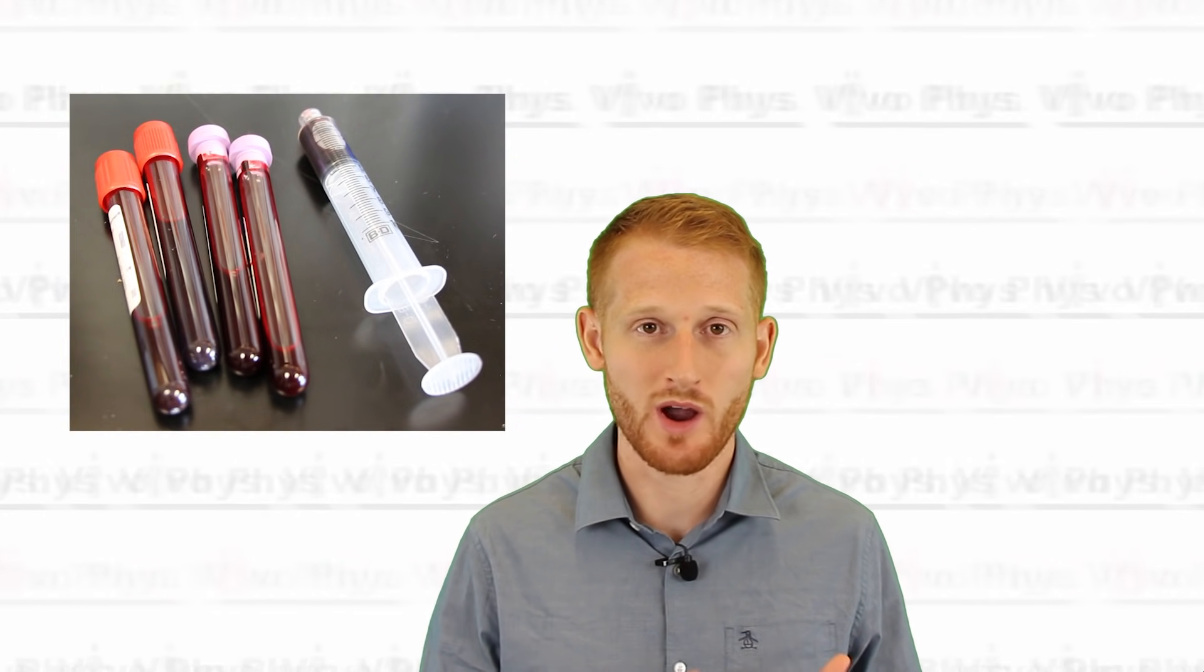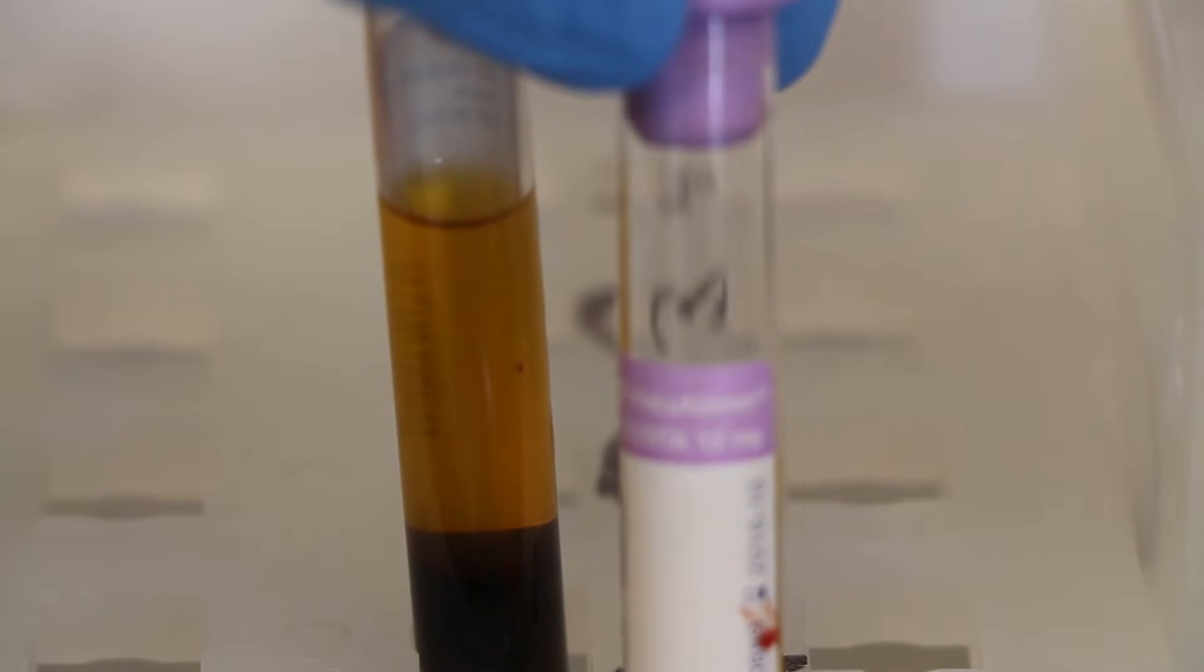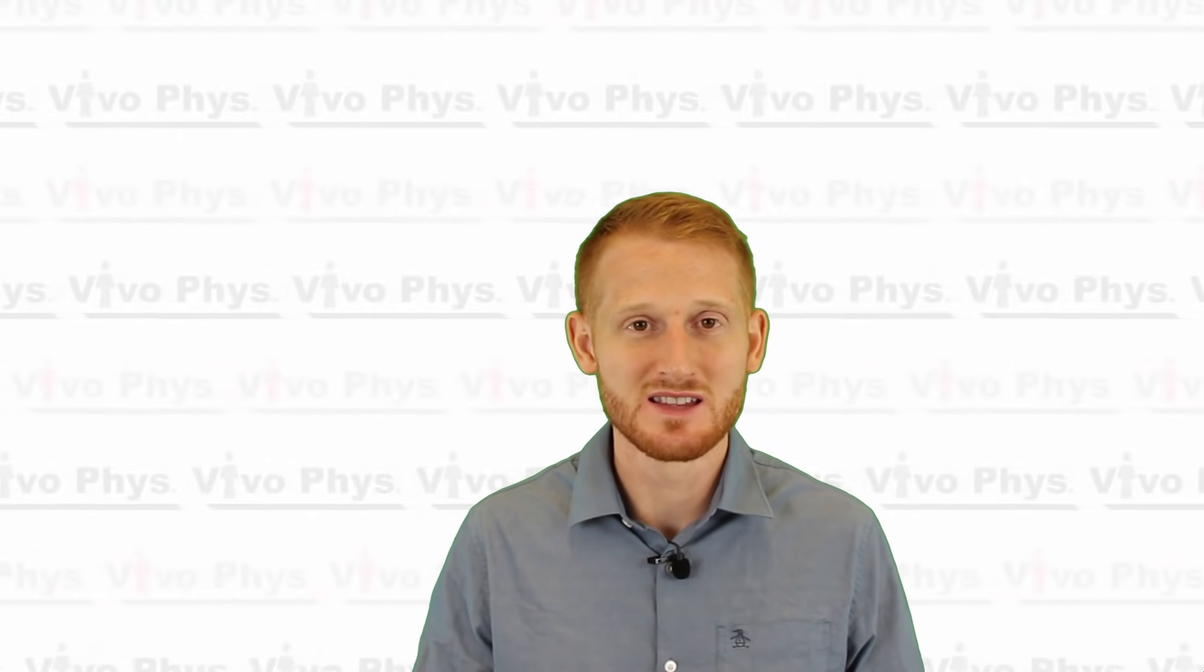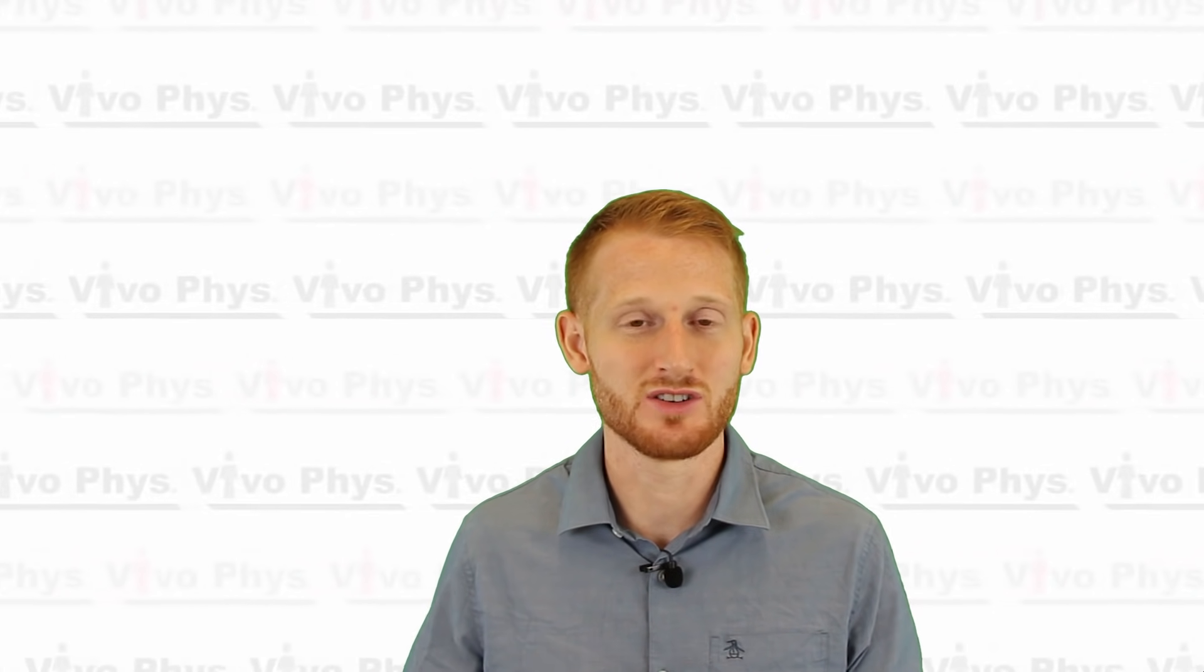The purple top are the EDTA tubes that are going to prevent the blood from coagulating. The red tops are going to be the silicone coated tubes that are going to promote coagulation of that blood. Whether you prevent coagulation or promote coagulation is going to determine whether you get plasma or serum. Plasma is what you get from the purple top tubes where you prevent the coagulation, so it still has platelets in it. Serum is what you're going to get from the red top tubes where you promoted coagulation. Essentially that coagulation is the clotting of those platelets, and so when you spin this down you're going to end up getting just liquid and no platelets inside that liquid.